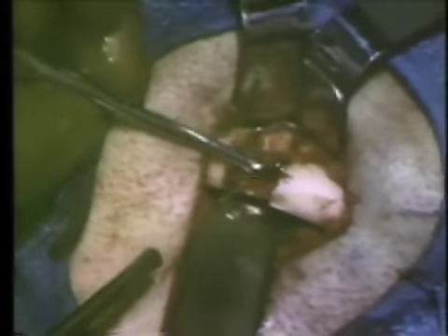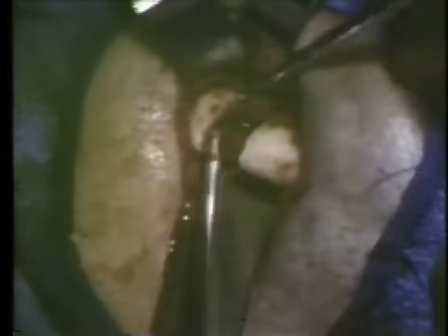And one thing that you will eventually note here is that when the lingual cortex that is bridging those fragments is removed, this space tends to collapse very rapidly, and the fragments are difficult to manage.